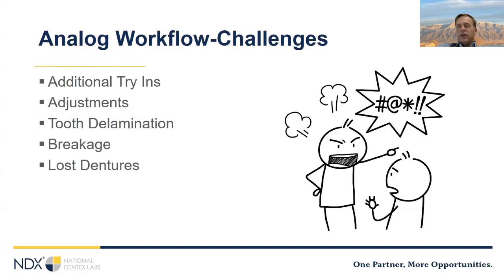So lost dentures, as you know, those are kind of the worst with analog, because you're like, okay, my data is gone, so to speak. I get to start all over again, and I've got to do all 5 appointments, which isn't that cool.